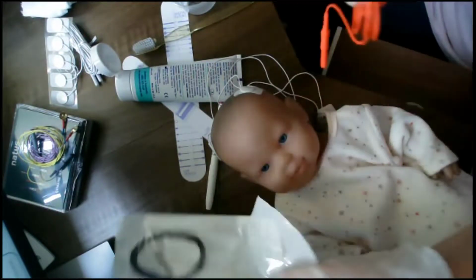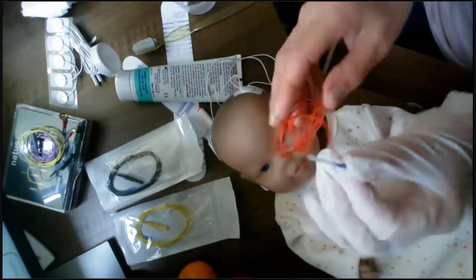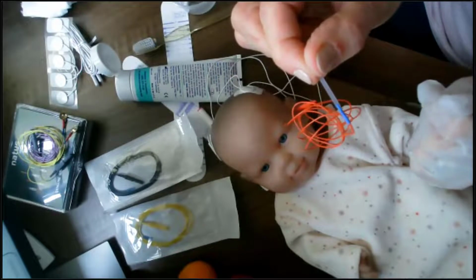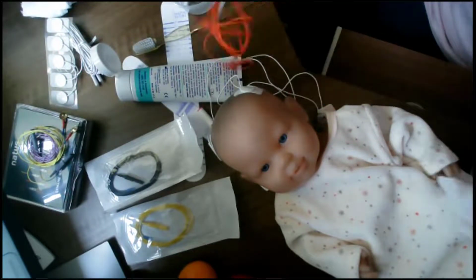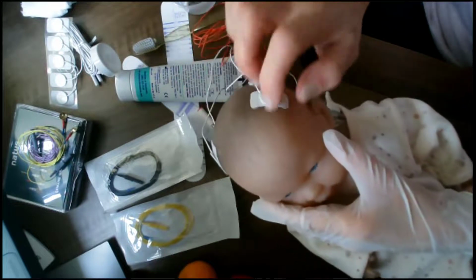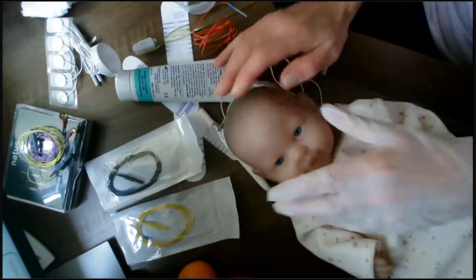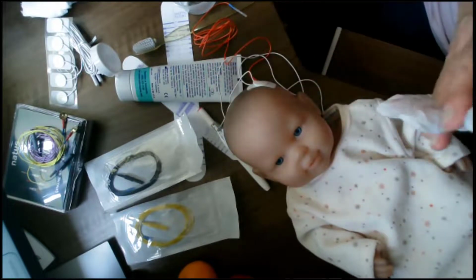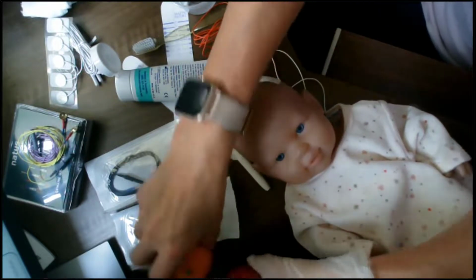I would just open the packet and I would take out the individual needle. Now you can see that it's got a small sheath on top, and I'm going to need to remove the sheath when I'm ready to insert. Now clearly this baby has a plastic head, and I'm not going to be able to get a needle into her. So for the sake of demonstration, and this is a very good tip and trick I would highly recommend everybody to use in training people to do this.